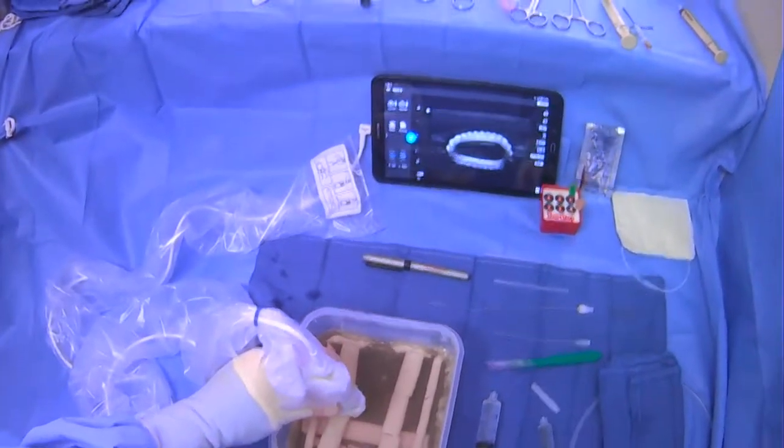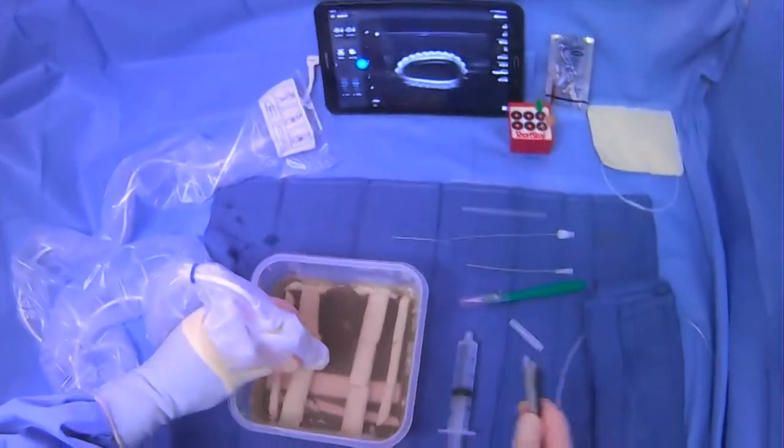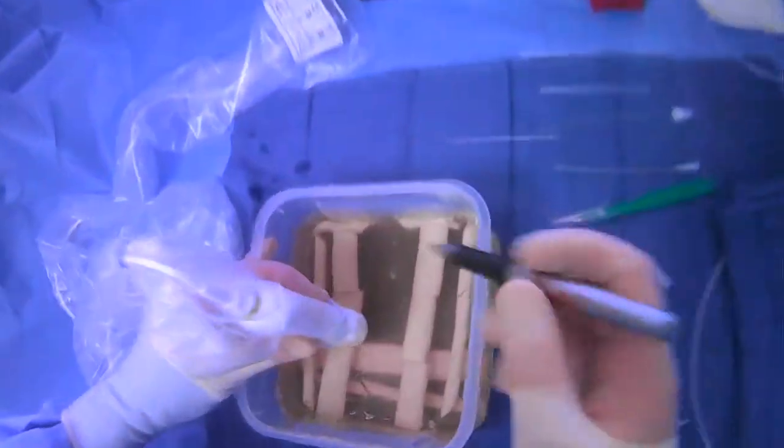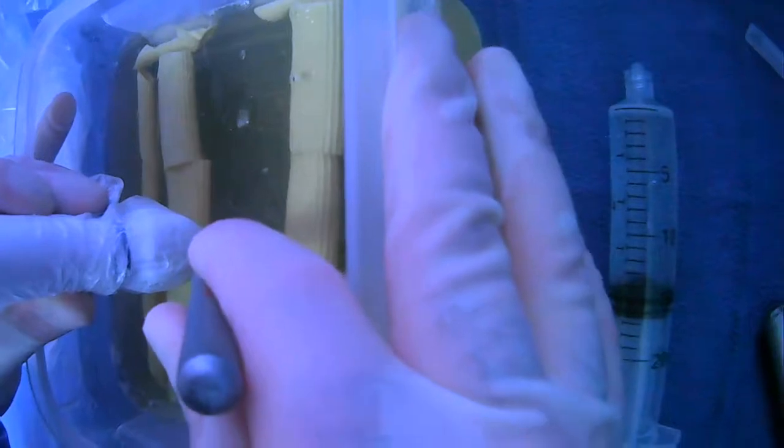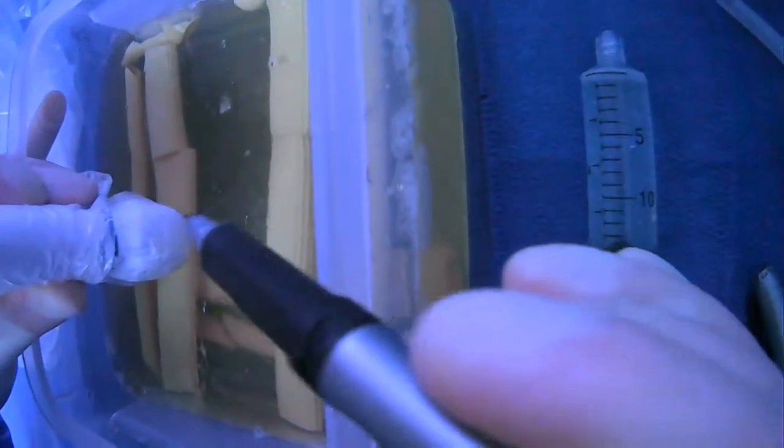Once we have our scanning done and we have a target and we know what trajectory we're going to take with the needle, we can take a skin marking pen and just come around here and pretend like this is going to be our needle and we can make a little mark here.